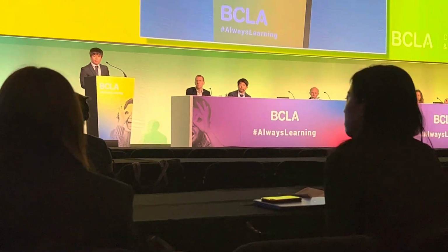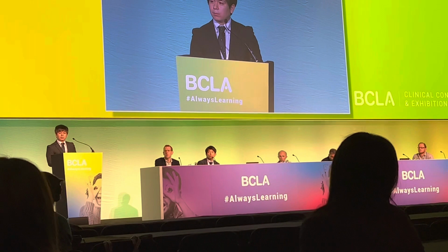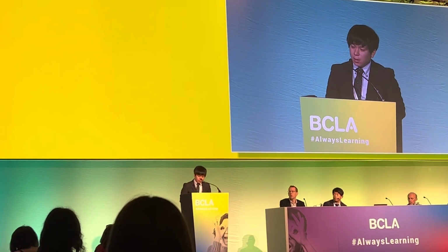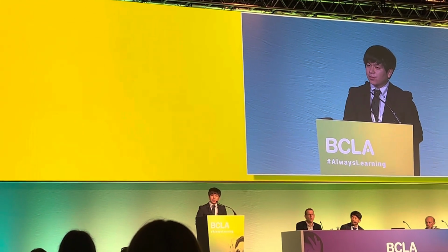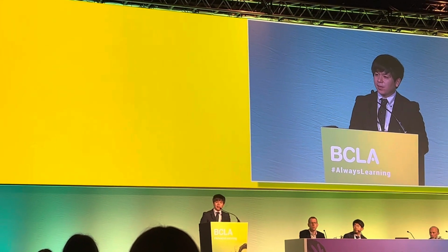Hello. In your presentation, what is the reason why the NIBUT of Alcon is that long? Thank you for your question. DT1-MF is characterized by a water gradient structure. As a result, it has good water wettability.